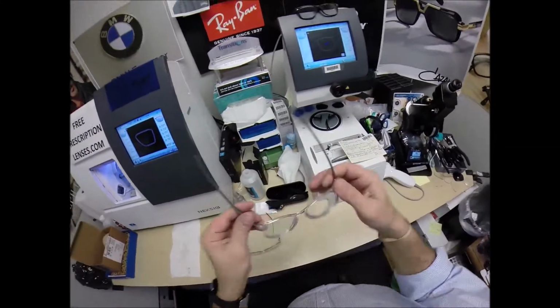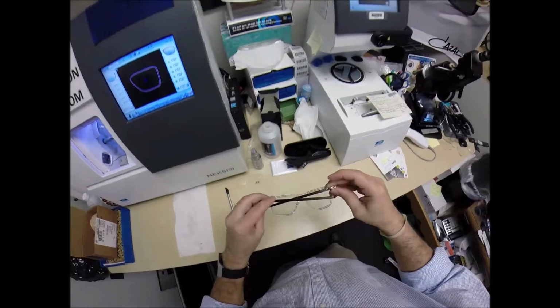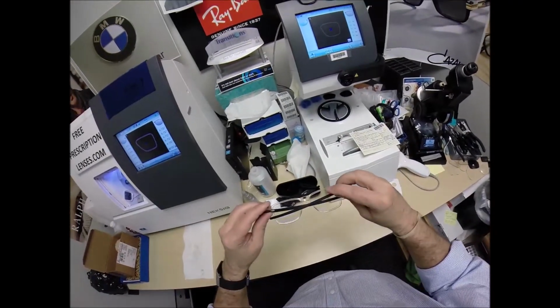But alright, let me put mine back on so I can see what I'm doing. Oh, that's much better. Flip that over, press down, there is no wobble. Close each temple to make sure they overlap perfectly, and they do.